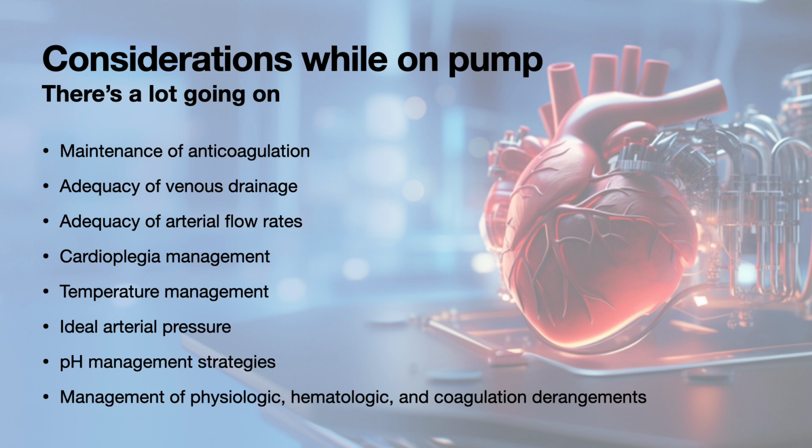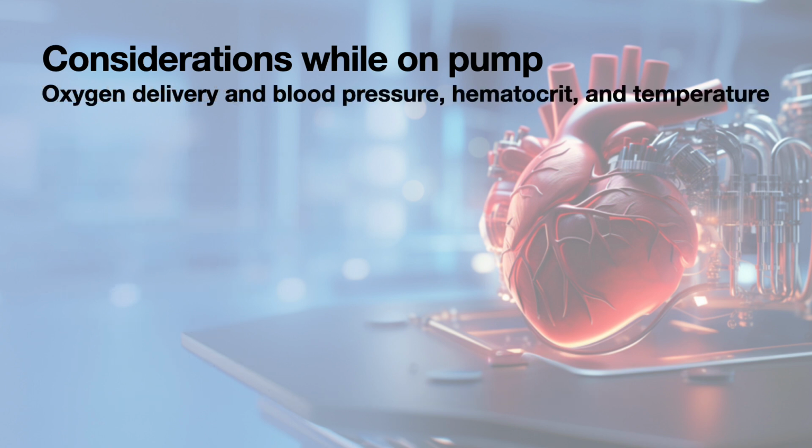I would suggest that ensuring adequate end organ perfusion ought to be your single most important consideration. Anything else is ultimately in service of that overarching goal. The goal of cardiopulmonary bypass is to keep oxygenated blood going round and round with a sufficient head of pressure to perfuse the capillary beds. Do that well, and your patient is likely to come through the pump run with fewer complications.